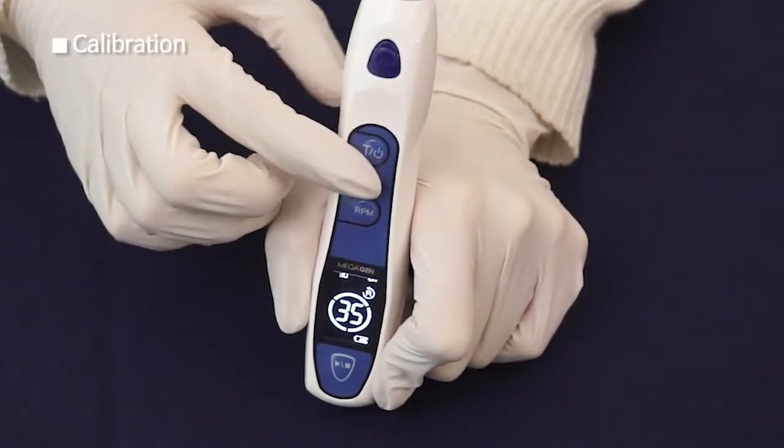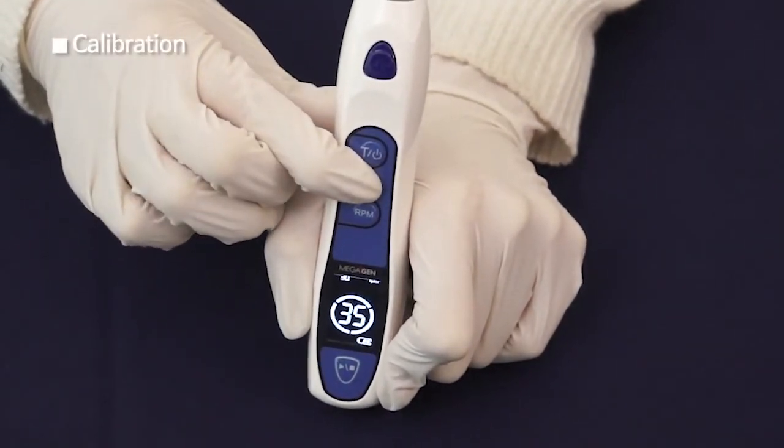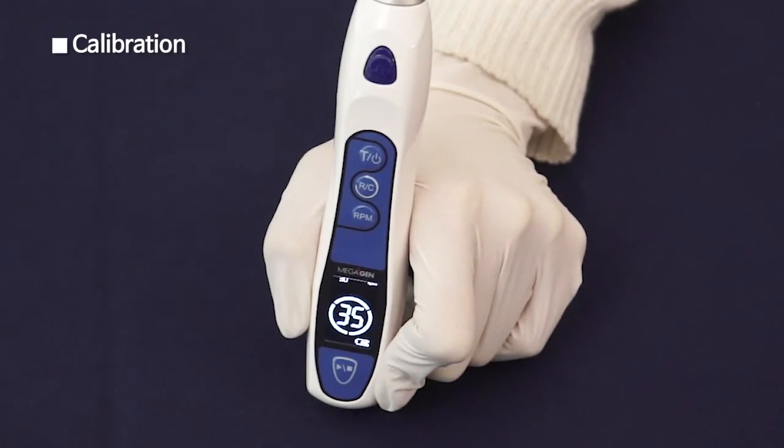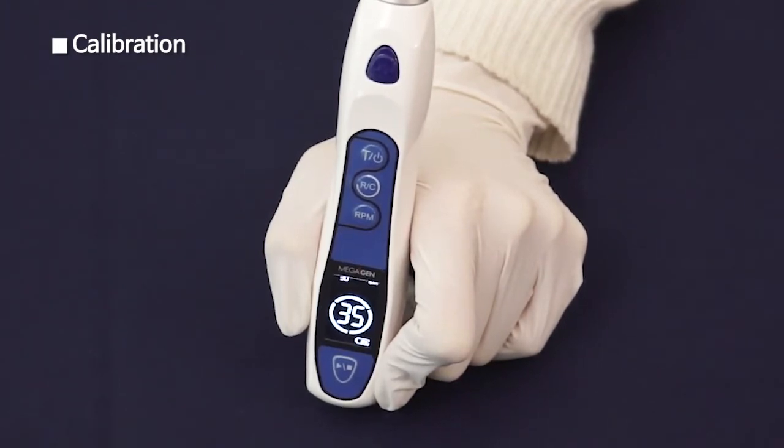Also, pressing it over 2 seconds starts calibration. The LCD panel shows Cal with a beeping sound and the motor runs. It automatically calibrates the torque value. In 3 seconds, calibration will be completed.